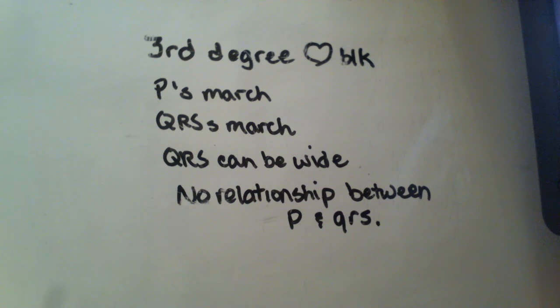So a temporary pacemaker they put in, it's almost like an IV in the arm, and then it's a little machine that hangs on an IV pole next to the patient, and the electrical impulse is given directly into the heart, not through the skin.